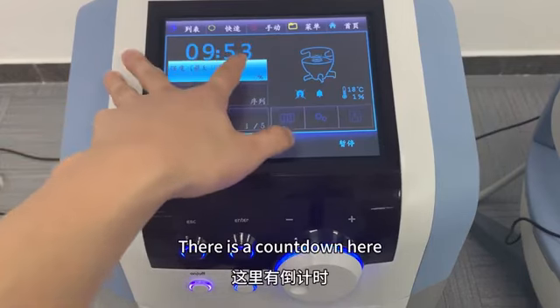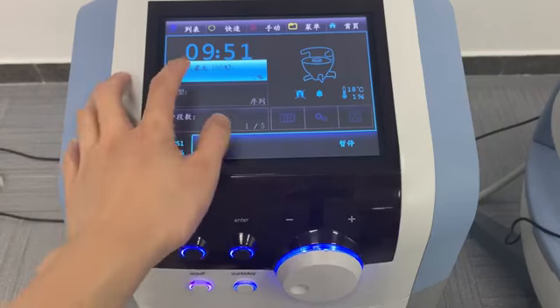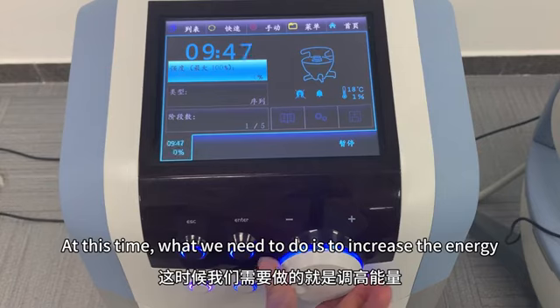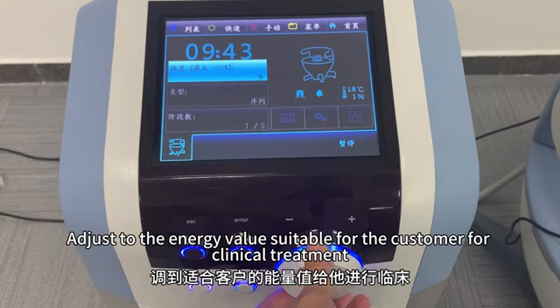There is a countdown here. This is the energy intensity. At this time, what we need to do is to increase the energy. Adjust to the energy value suitable for the customer for clinical treatment.